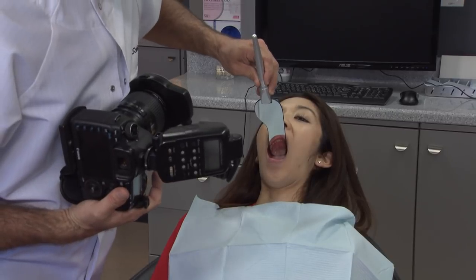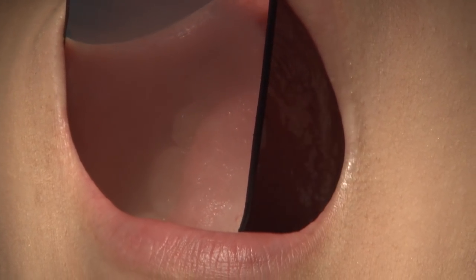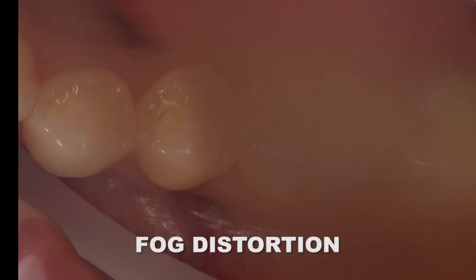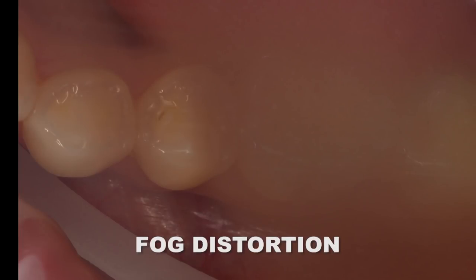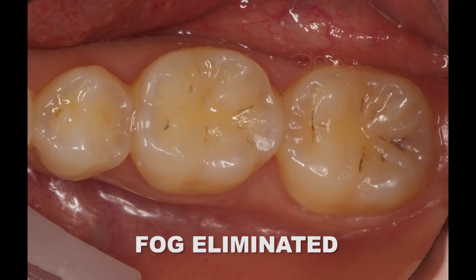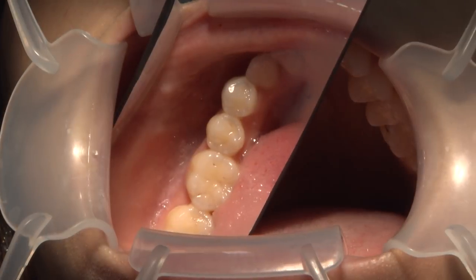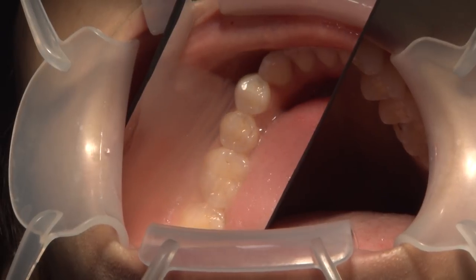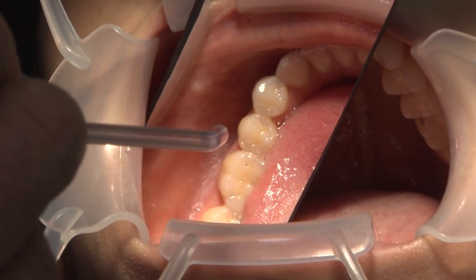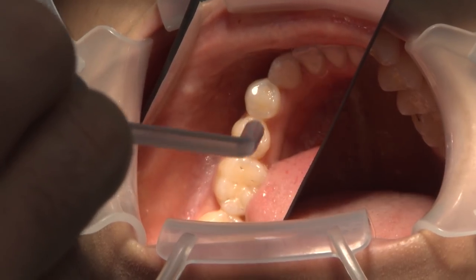Intraoral mirrors are most susceptible to fogging from breath condensation. A mirror can be heated in water to minimize fog accumulation; however, I try to stay far away from this method simply because the water adds one more layer of distortion. Instead, simply applying a steady air blast from an air water syringe will instantly defog the mirror and allow for a clear, reflected shot.